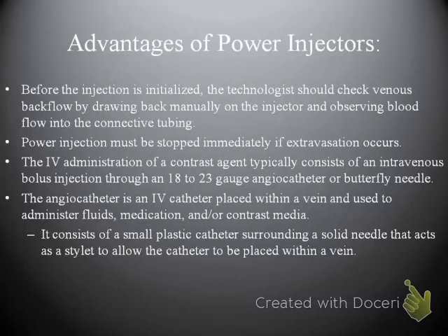Rarely, if the patient is properly hydrated and the IV is in an excellent spot, usually infiltration does not occur. But on the off chance that it does, it's important for us to be aware and mindful of what we can do about it.